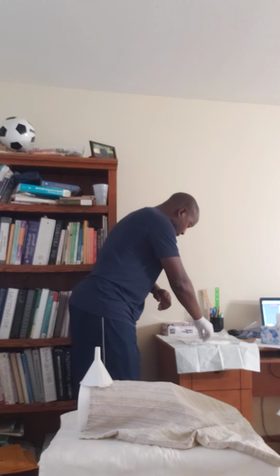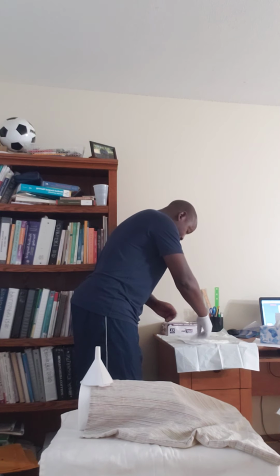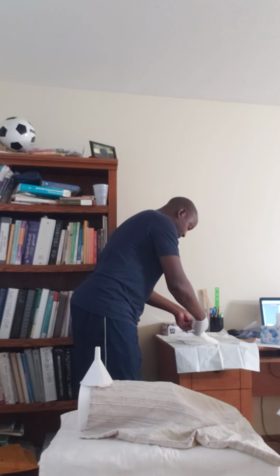I just touched it here, not at the middle. It's okay because my skin here is in contact, and my skin has been washed. But I have these sterile gloves, and then I can touch in the middle or I can touch inside.